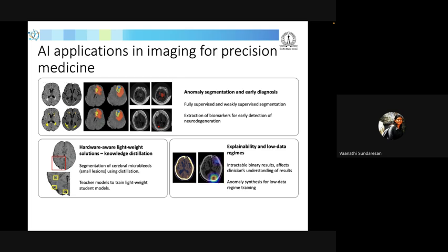And the other issue is the annotations. The doctors are ready to share data to some extent, but for them it's a huge burden. Already there is a burden on them because of the population in our nation. So it's not possible for them to sit and annotate for hours. It takes 2 to 3 hours for certain disease signs, especially when they are small. They have to search for it and look closely in a 3D volume. It easily takes 3 hours per volume, right? It takes a lot of time. So annotation and even the data is very scarce. That's why we need to work on low data regimes. So how can we consume very few resources and still provide a very robust model?